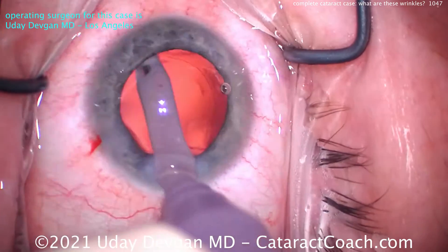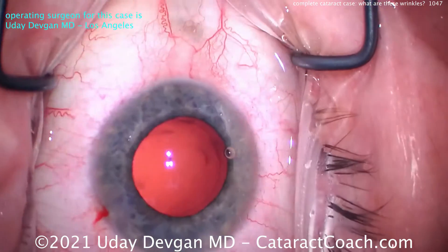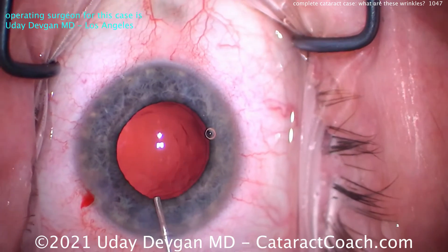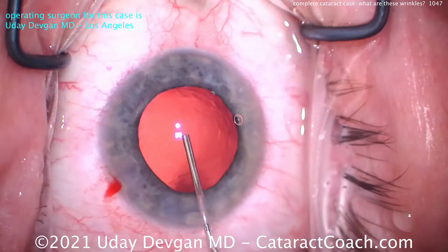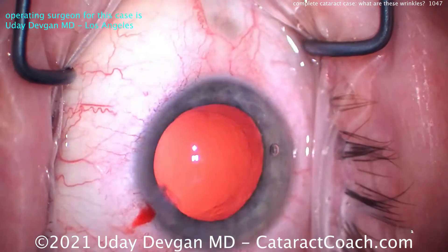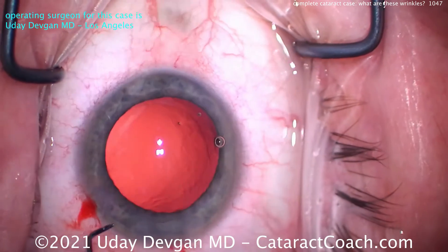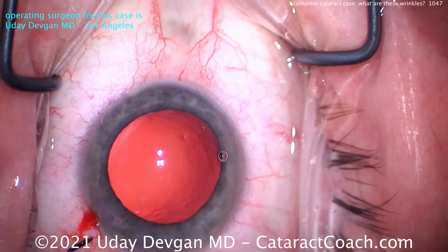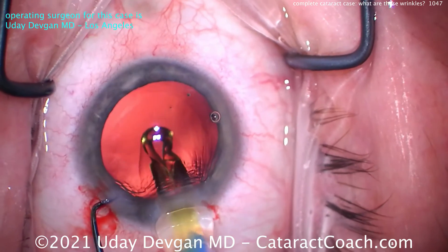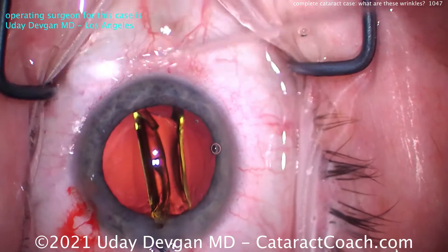The tech is loading up our lens for us. This is going to be a single-piece acrylic lens. This patient has a mild degree of pre-operative hyperopia — I think like plus two — and we're putting in about a 23.5 diopter lens, aiming for a post-op refractive outcome of close to plano. Good fill of the capsular bag with the cohesive viscoelastic. There's still a lot of patient movement — that's okay, patient's comfortable, pain-free, not aware of too much, and we're happy as well. Here comes the lens — going to deliver that into the capsular bag, nice and easy. Beautiful dial — that's in the bag.